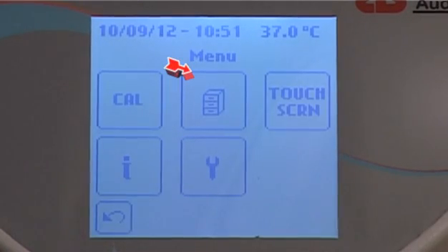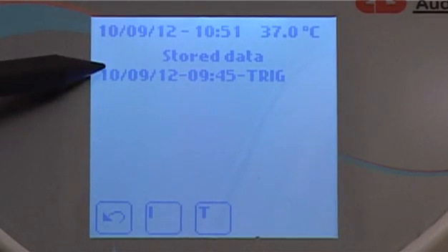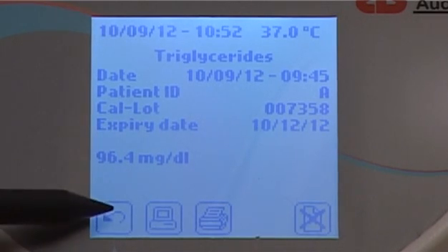The stored data icon opens a rolling database where a thousand test results can be saved. It is possible to search for results by patient ID or test name. The details of the test stored include the date, time of the test, patient ID, Cal lot number, and expiry date.